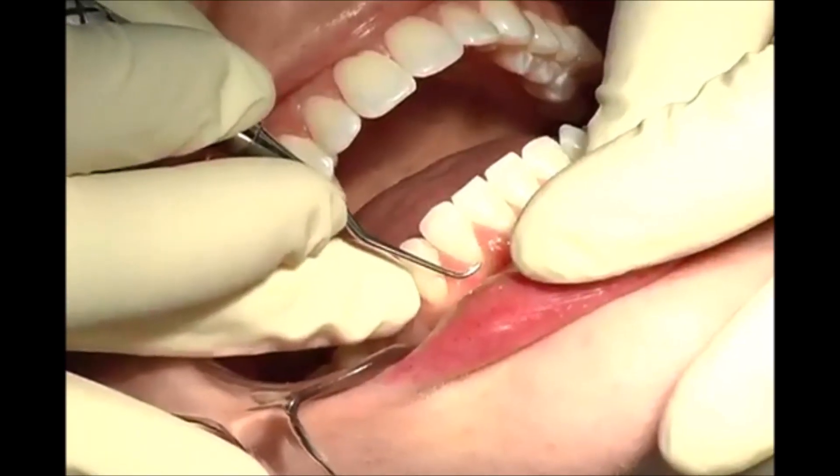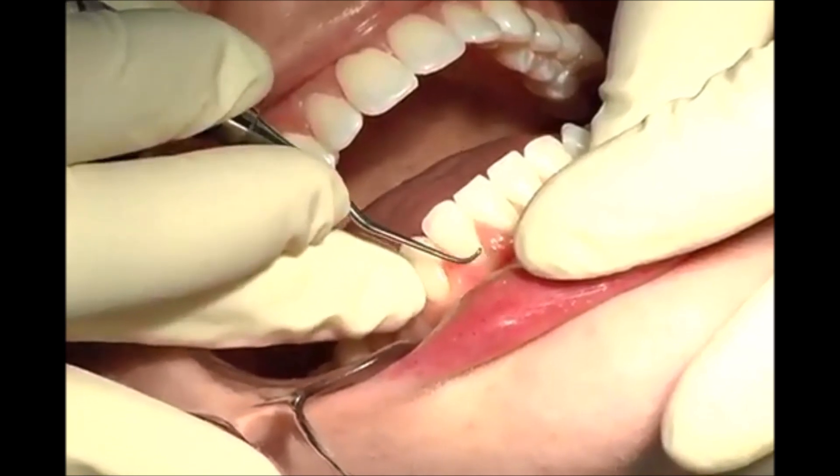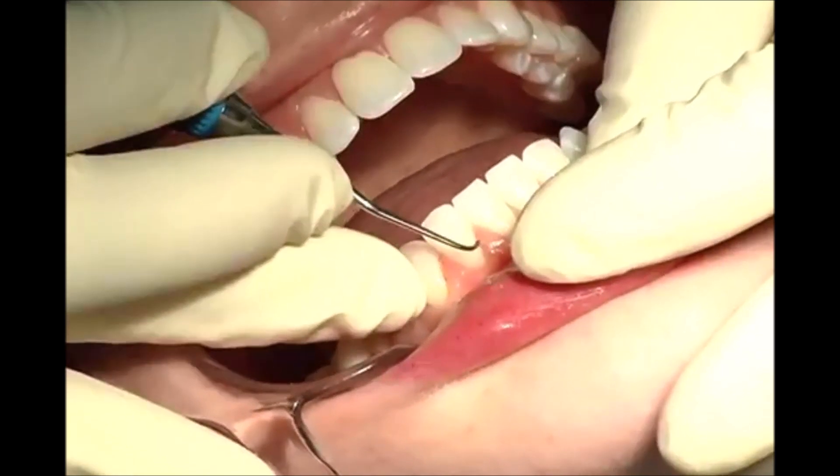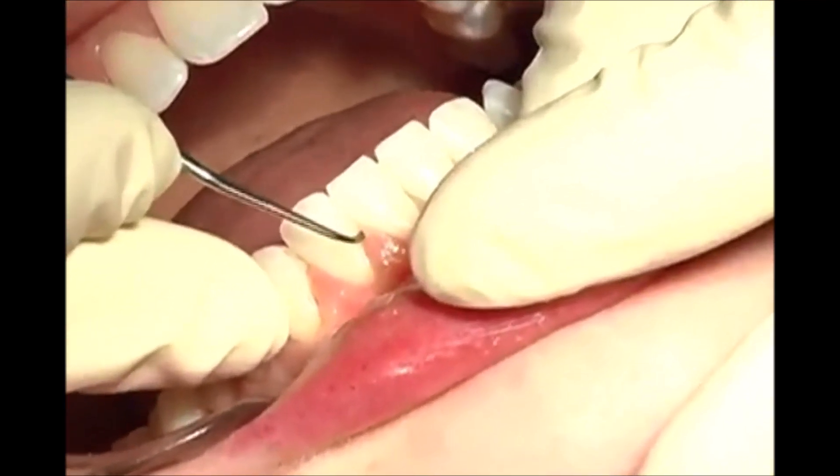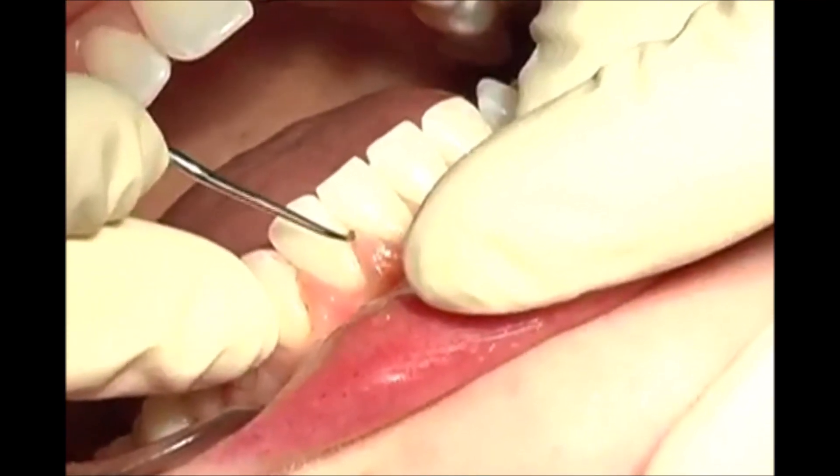The Micro Mini Gracie curettes feature the great benefits of the Mini 5 curettes with 20% thinner blades. This is beneficial for accessing narrow subgingival spaces, furcations, and root concavities.